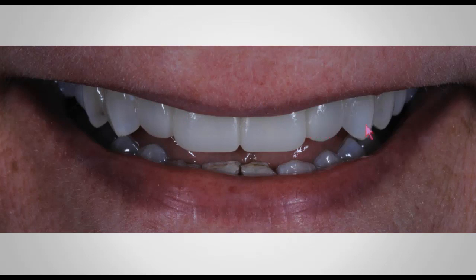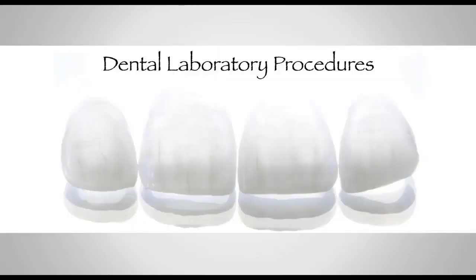They're all bonded together, one right next to the other, and they're bonded through a spot etch and a little bit of adhesive only on the spot etch area directly onto the tooth. So once I do this prototype, I never remove the temporary. I only polish it, and the patient goes home because it's already bonded to the area that I spot etch, and I add the adhesive directly onto the patient's tooth.